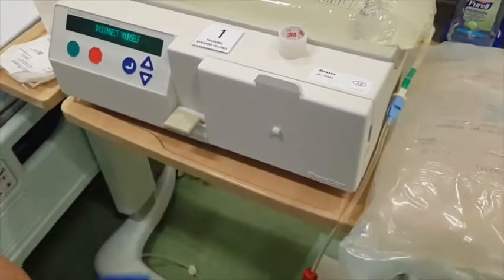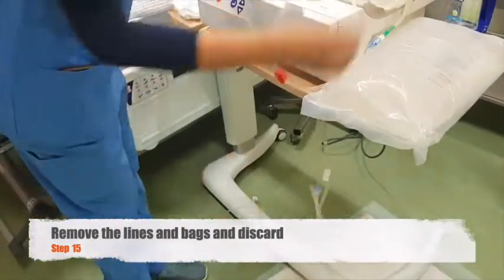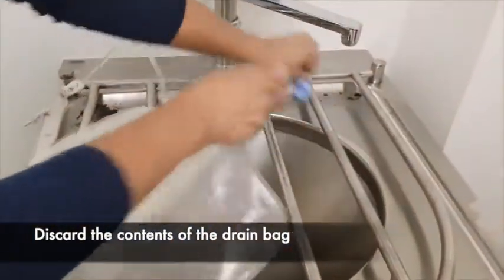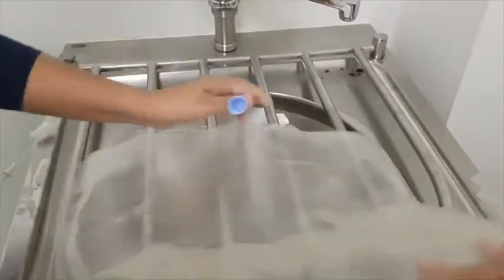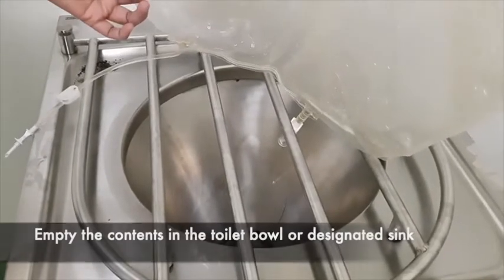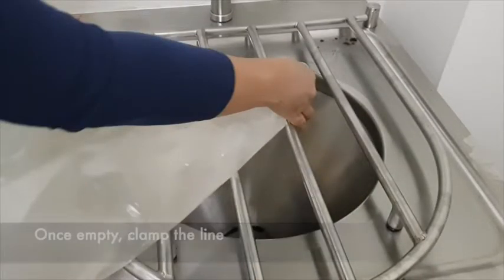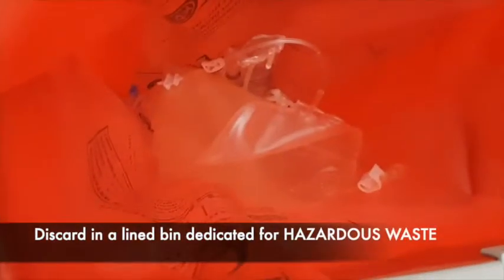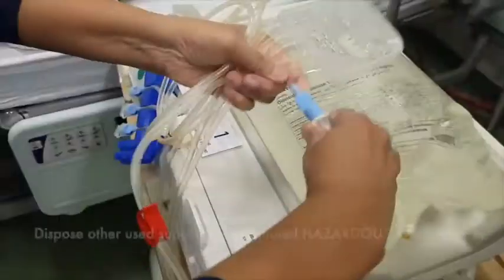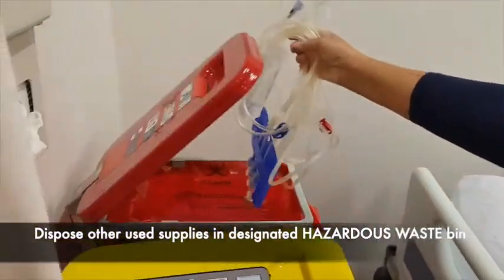We can now proceed to removing our lines and bags to discard them. An important point is to remember to discard all the contents of the drain bag. You may opt to discard the contents in a toilet bowl or a designated sink in your hospital. Once you are sure that the bag is completely empty, clamp the line to avoid any spillage. Then, discard the bag in a lined bin dedicated for hazardous waste. Similarly, you may also opt to discard all your used supplies in the designated hazardous waste bin.